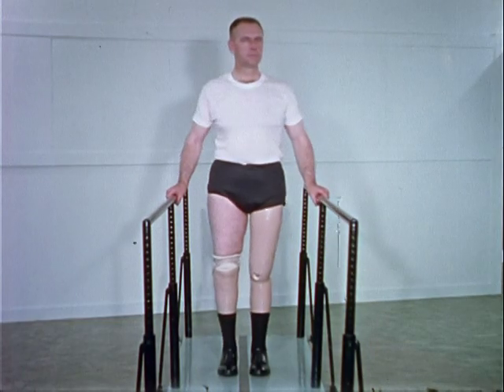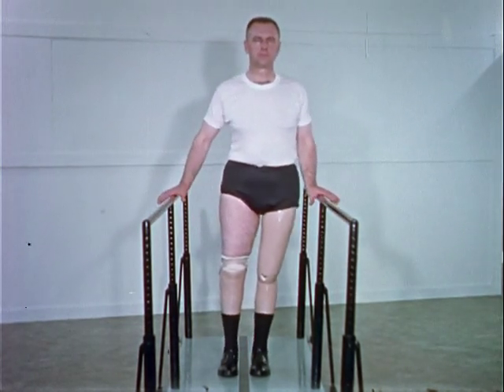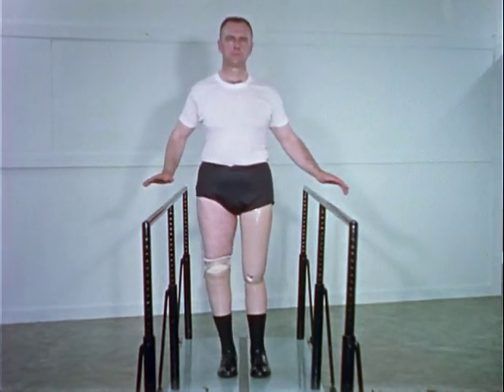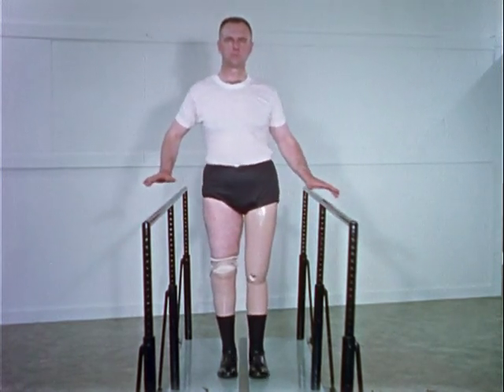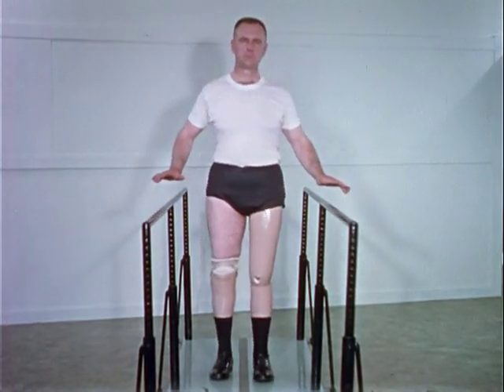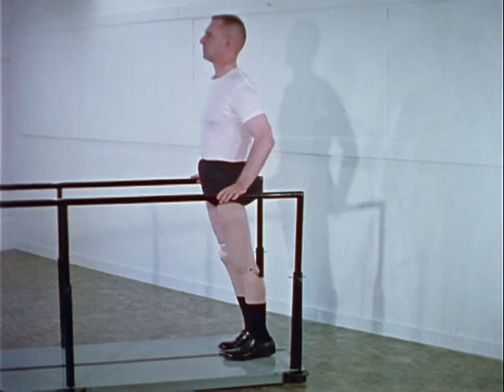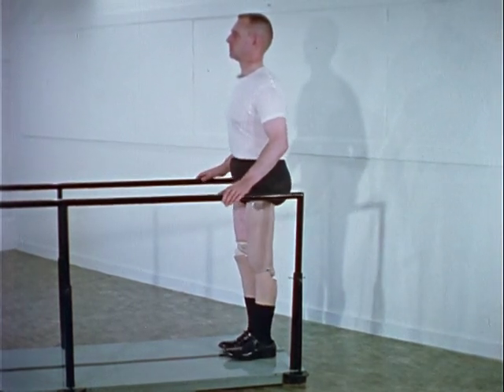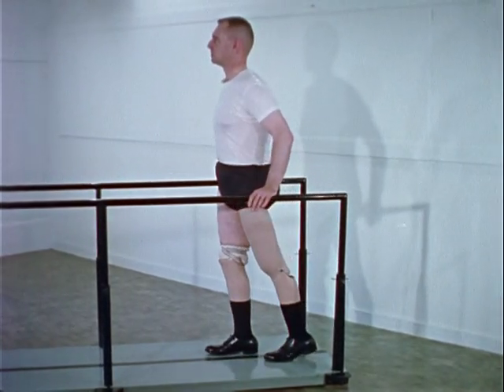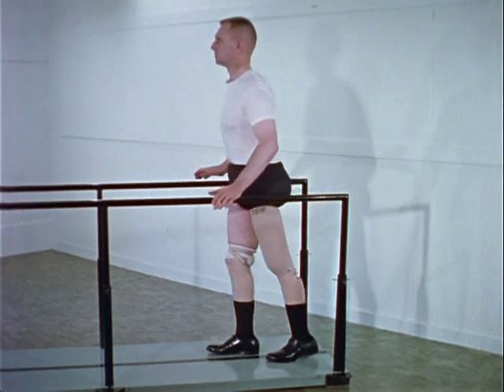Early gait training activities are concerned with learning to balance on the prosthetic legs. With the pelvis and shoulders level, the patient shifts his weight laterally, first with and then without hands, and progresses to balancing on one prosthetic leg. Forward and backward shifting of weight is practiced. The patient advances to shifting his entire body weight onto the forward leg and stepping through with the opposite leg.